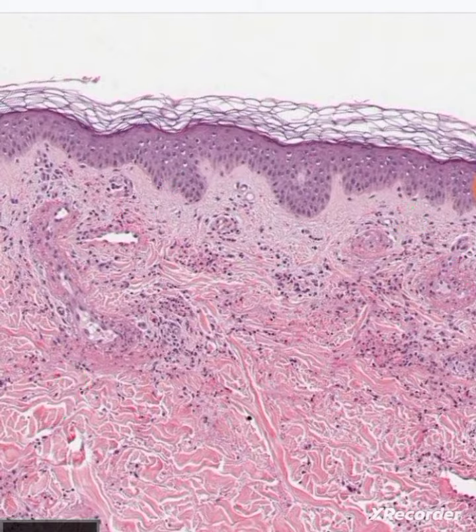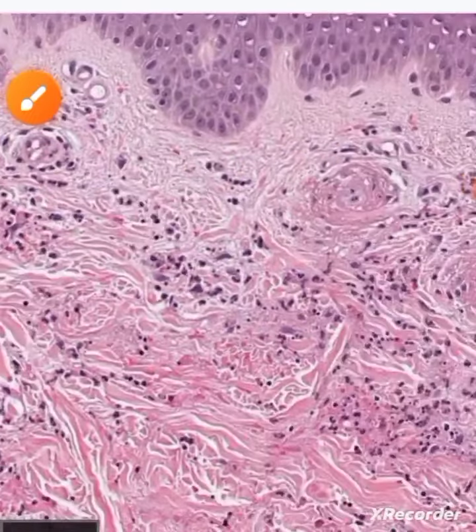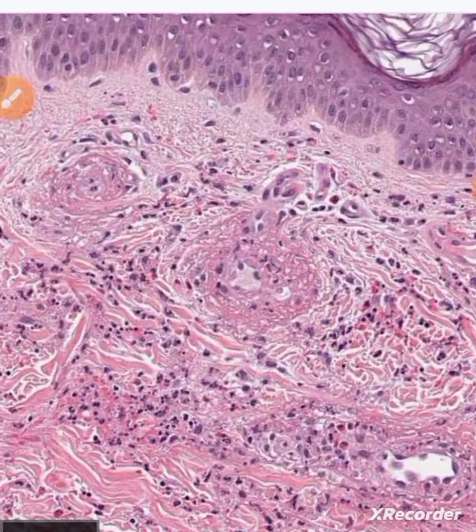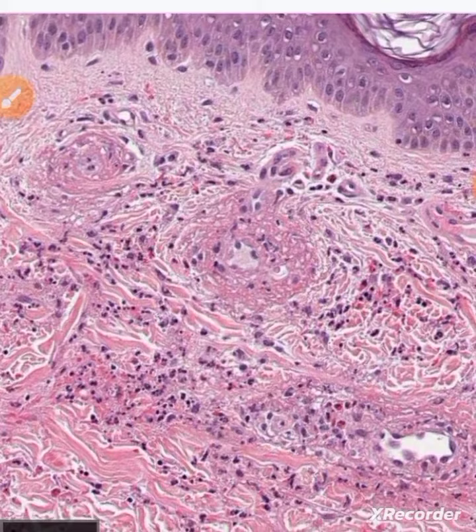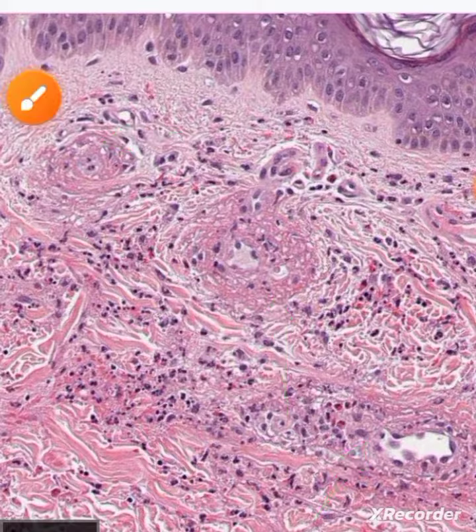If we take a closer look, these blood vessels are surrounded by this pinkish material, which is basically fibrinoid degeneration or fibrinoid necrosis.